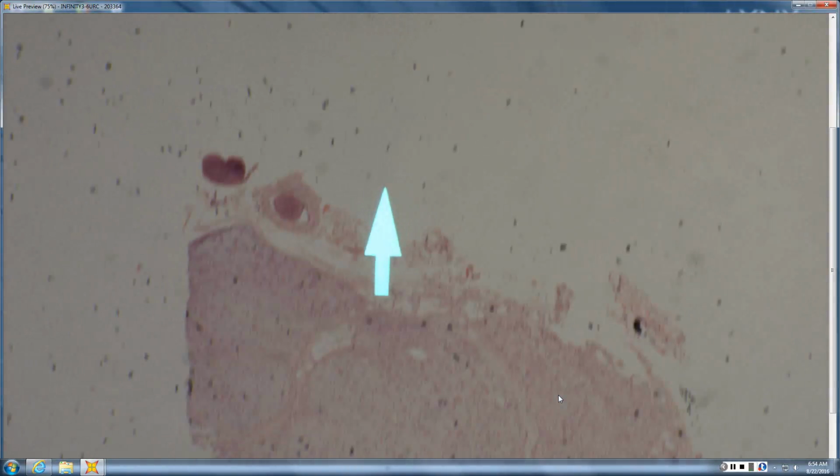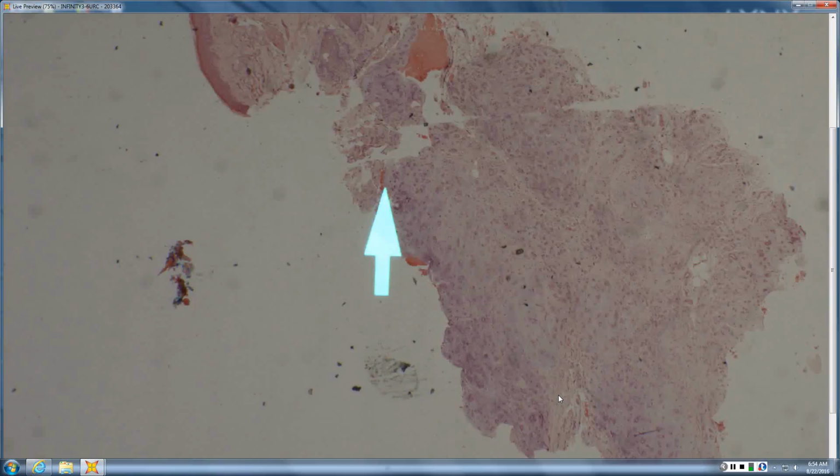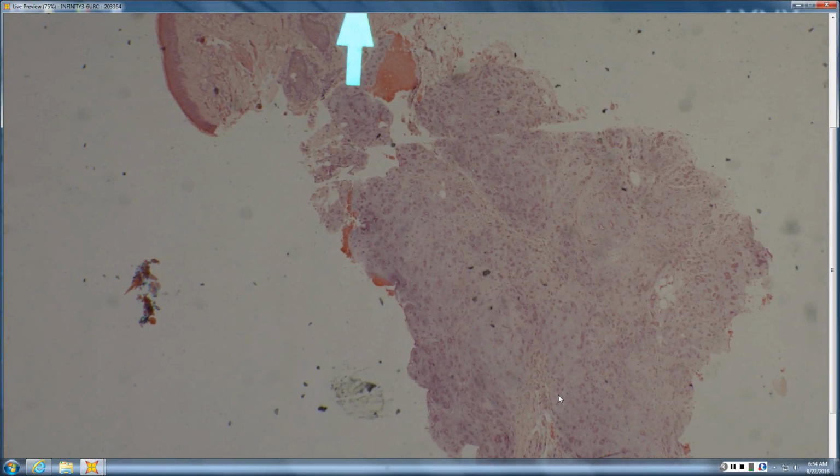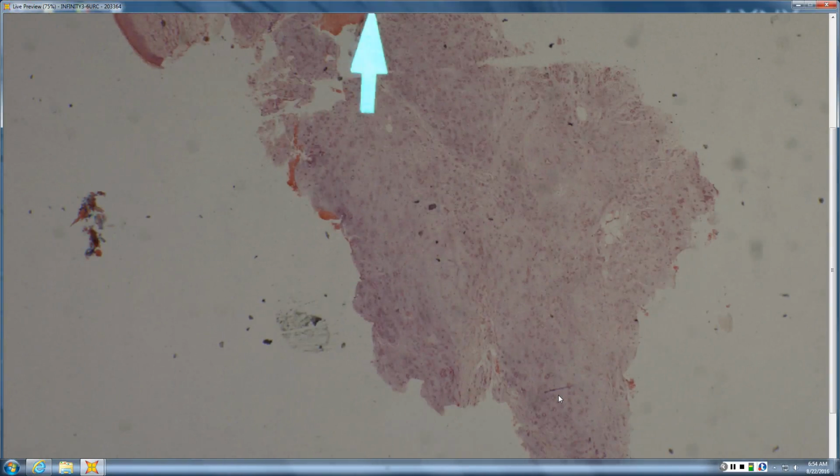Okay, so this one is a mixed tumor, and this is the small tubular type. The slide's a little bit faded, but we're in the skin, so we know that. We see skin up top, and then from scan, we see this sort of bluish mass here in the deeper dermis, and it almost looks like cartilage.